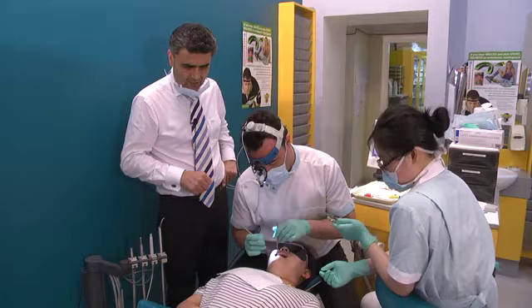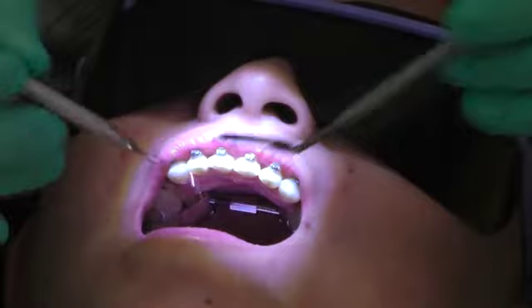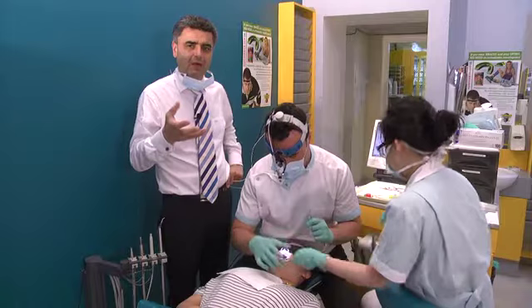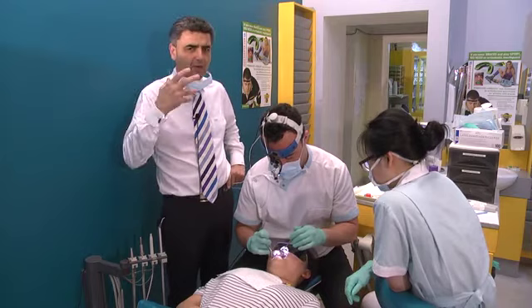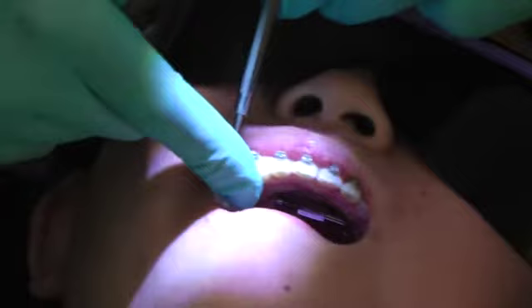If you're doing this in a mixed dentition case, which is normally the case, you always warn the parents that any deciduous teeth that are about to fall out will of course come up with the hyrax. Because if you don't tell them that, some parents get upset thinking why did you take that tooth out unnecessarily — when it was a tooth that was going to fall out anyway. But if you warn before you perform, there's less chance of any dramas.